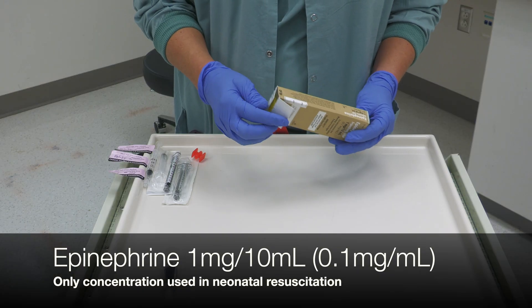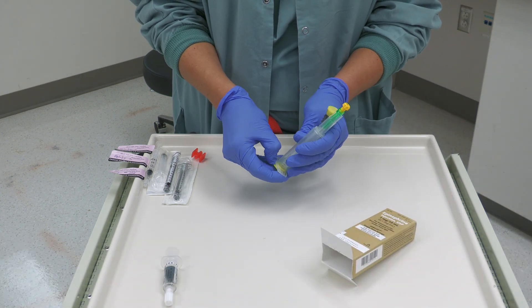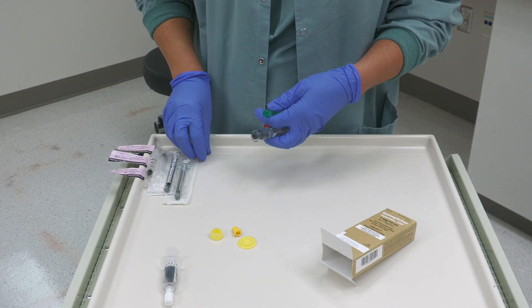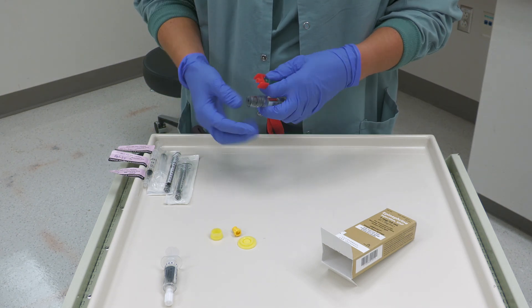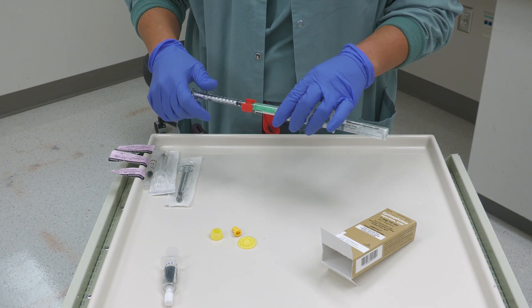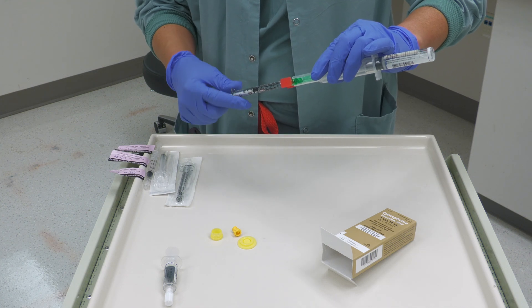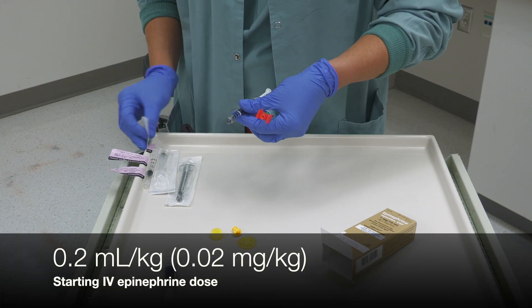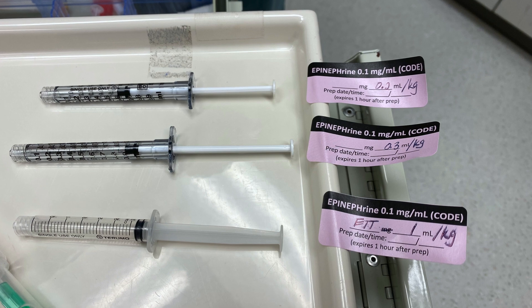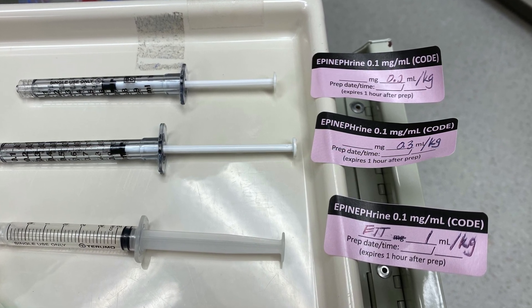A team member should prepare epinephrine doses as soon as the UVC is being considered. Start by popping the tops, then connect the vial. Place the fluid dispensing connector between the epinephrine and the syringe you will use to draw up the dose. Draw up IV doses of epinephrine into a 1 cc syringe, and any ET tube doses should be drawn up in 3 to 5 cc syringes. The recommended starting dose for IV epinephrine is 0.2 mLs per kilogram. You may also want to prepare a higher 0.3 mL per kilogram dose.